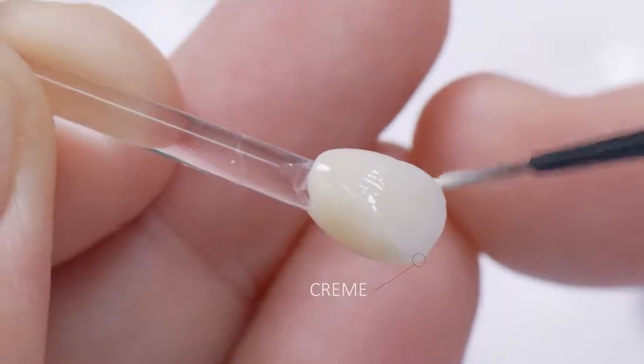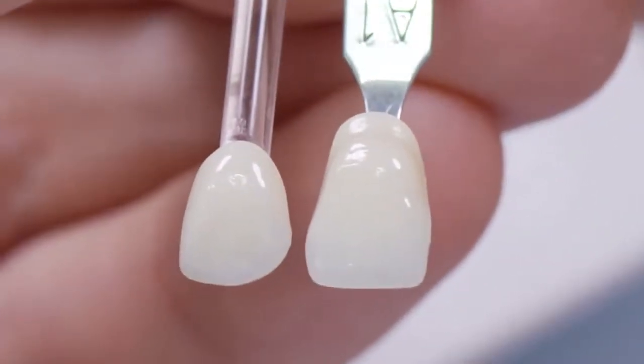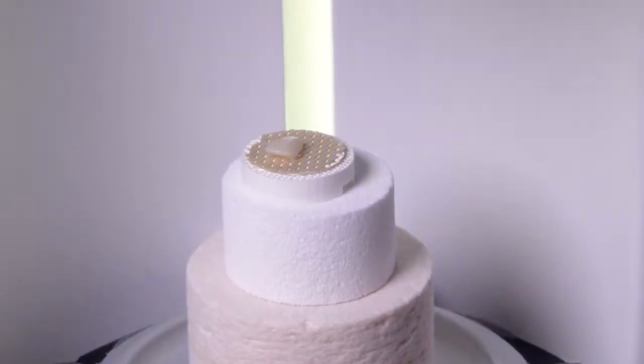Cerec Ticera demonstrates its special color fidelity and brilliance in direct comparison with the shade sample. Now the veneer can also be fired in the preheated Cerec Speedfire.